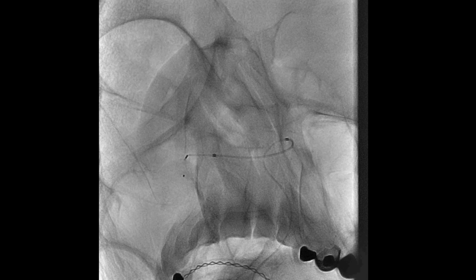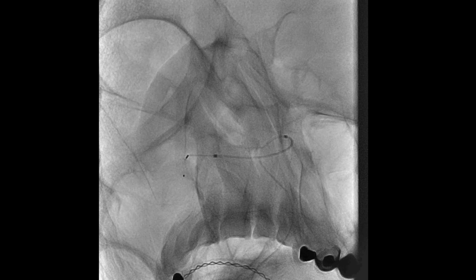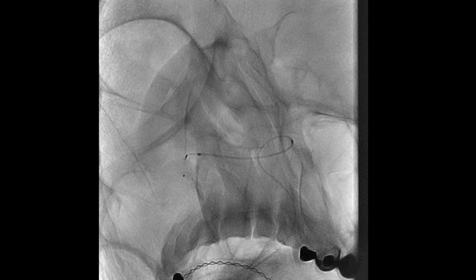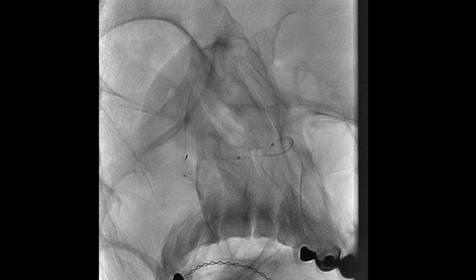Here's a useful tip to prevent stubborn folding. Start your derotation early, before the distal end fully opens, by gently pulling back both the catheter and pusher wire together. Do not wait until the distal end fully expands.